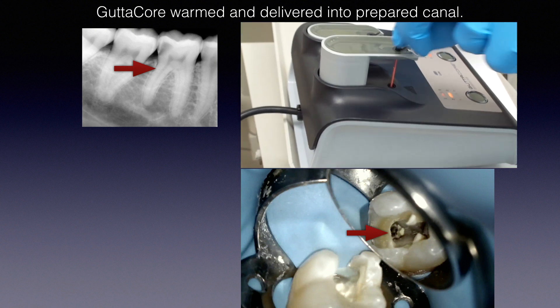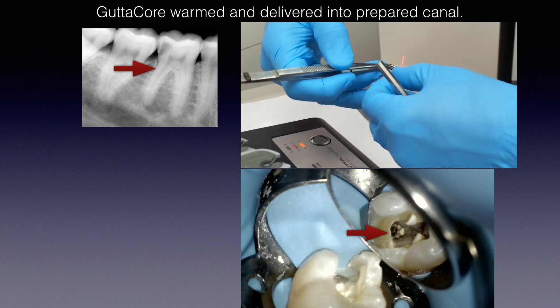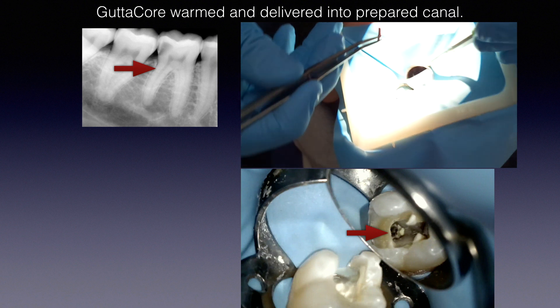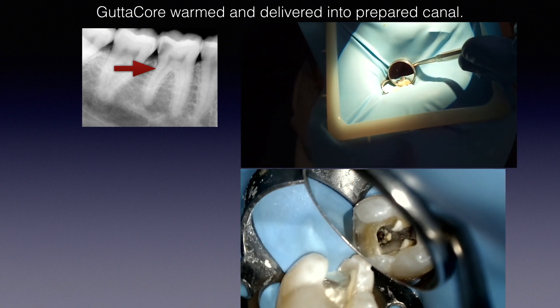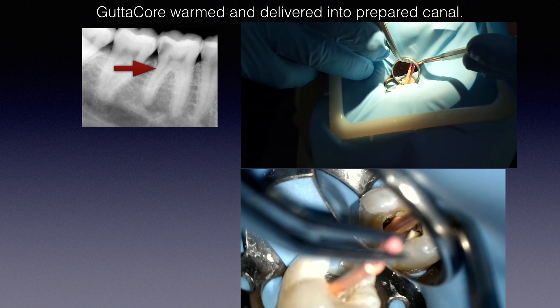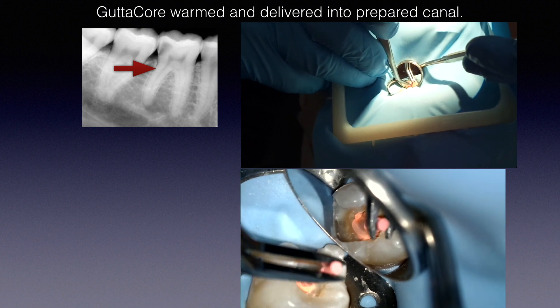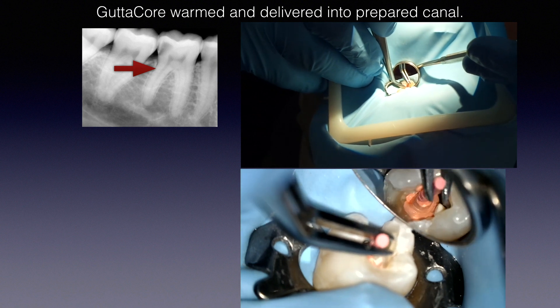Take out the obturator and grab it with cotton pliers. I'm looking at the built-in marker — the ruler on the obturator — that tells me exactly where to break it off. It's not arbitrary. Notice the speed with which I carry it from the oven to the tooth — a smooth, quick flow — and then I'm counting about seven to eight seconds as I place it inside the canal.